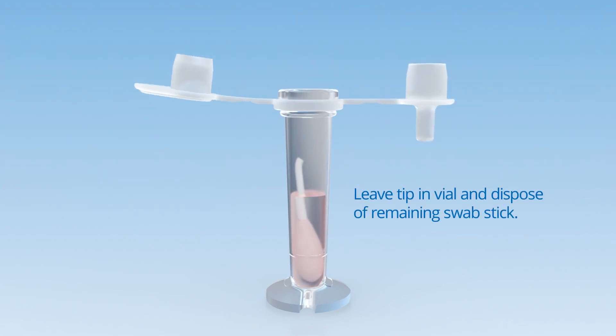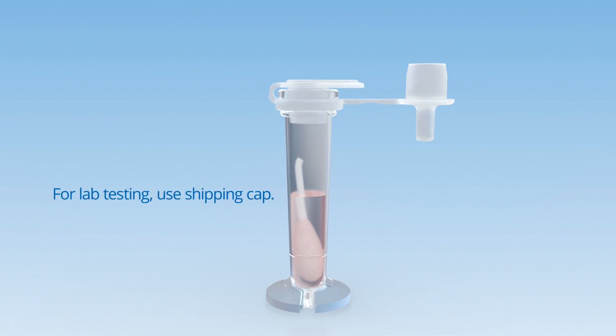If reading the test in the lab, replace the shipping cap firmly on the vial, label the specimen according to your hospital protocol, and send the specimen to the lab for processing.